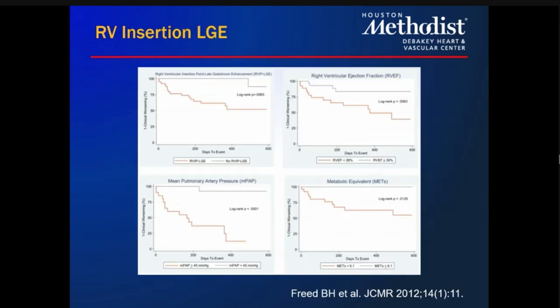RV insertion LGE does come up every now and then. I have been asked whether or not it has any kind of prognostic impact. Turns out it does. In pulmonary hypertension and HOCM patients, RV insertion LGE does have an effect on clinical outcomes. So that's why we still note it in our reports when we do it.